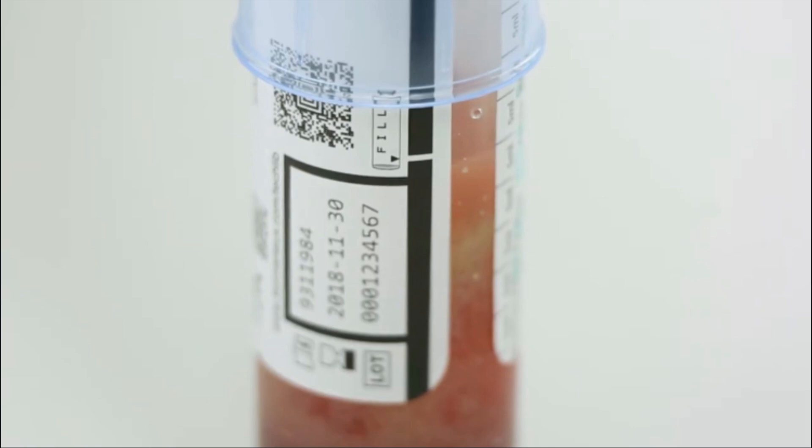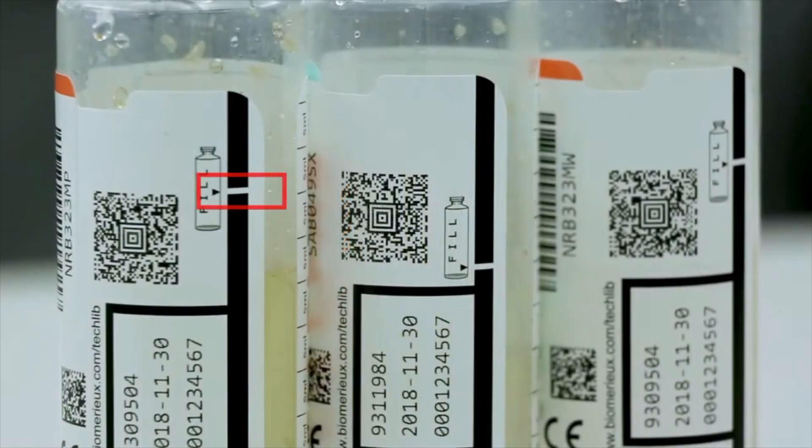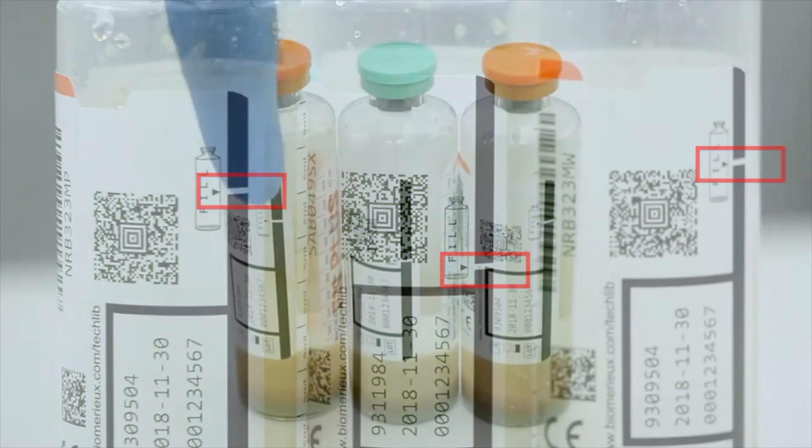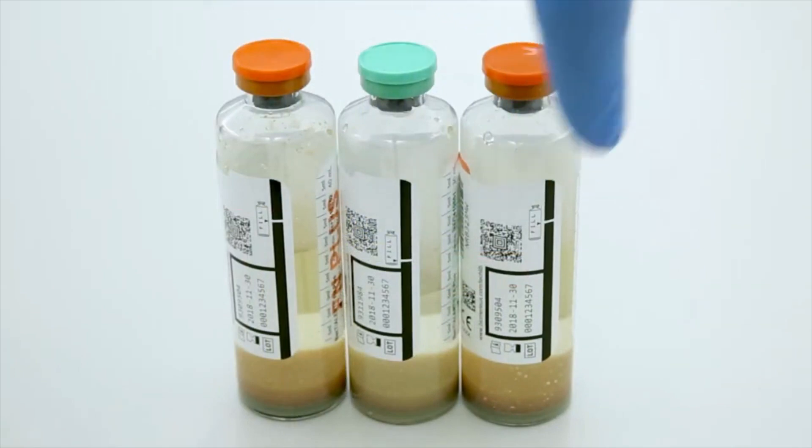Two, it allows BACT/ALERT VIRTUO customers to automatically measure specimen blood volumes for each bottle containing the fill to mark feature. This is an example of how the label may appear due to certain bottle differences — for example, variable media volumes. Not all bottle labels will contain the same elements. Remember, the etched white zone is the fill to mark.